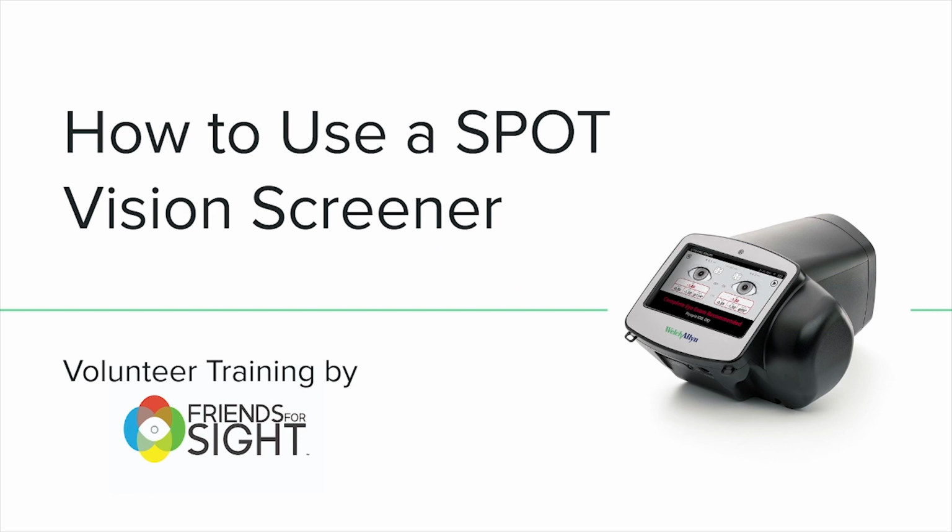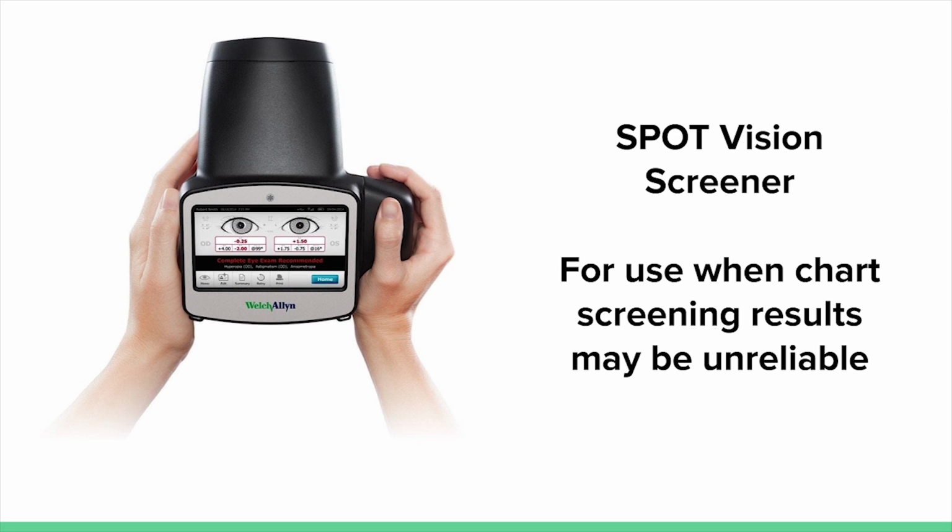In this presentation, we will be reviewing the basics on how to use a Spot Vision Screener as a Friends for Sight screening volunteer. The Spot Vision Screener is a camera-like instrument that can make a general assessment of a person's vision. It is a useful tool for conducting vision screenings on young children.